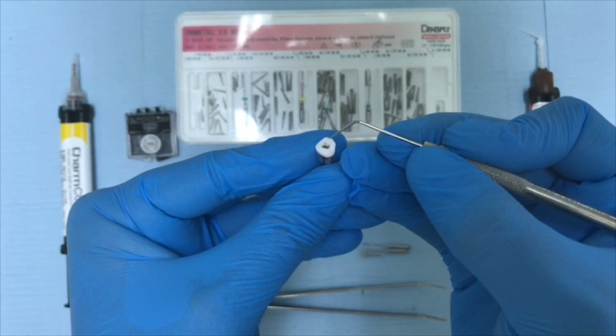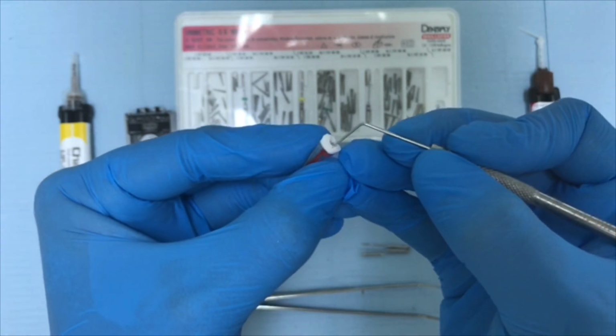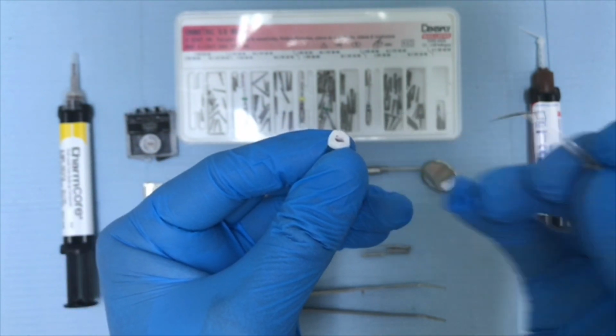So, placement of such a direct composite restoration in this part will not show maximum success unless you put a post in the root canal system of this tooth in order to retain the core in its place.